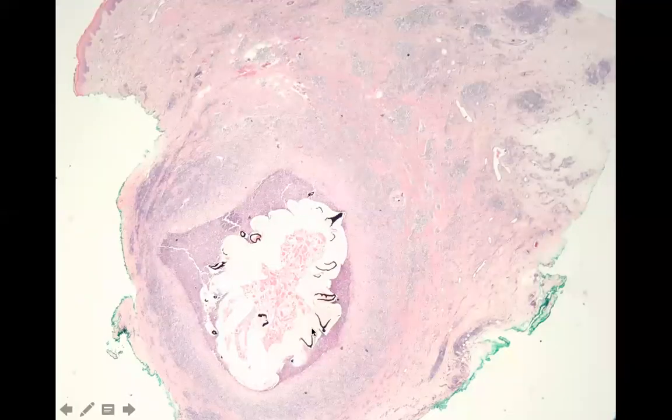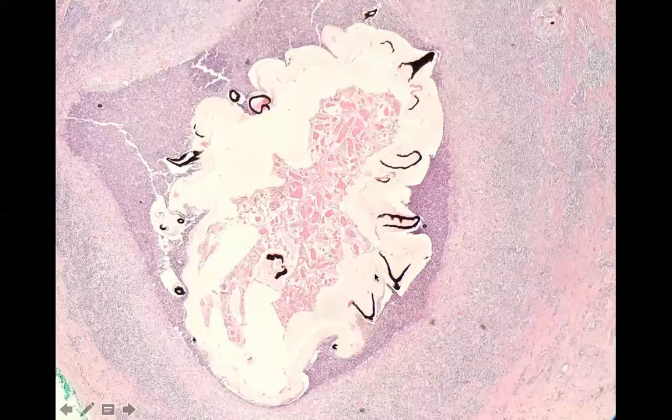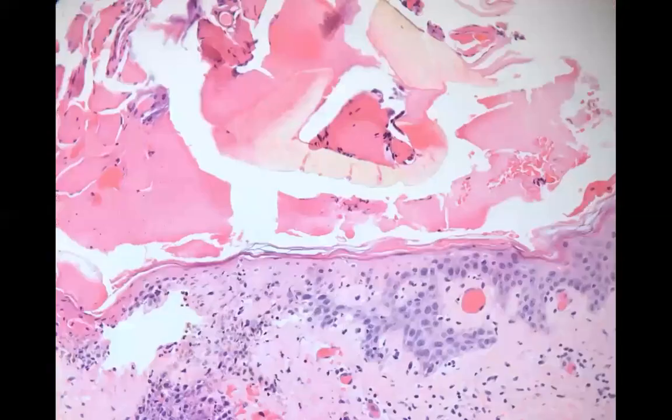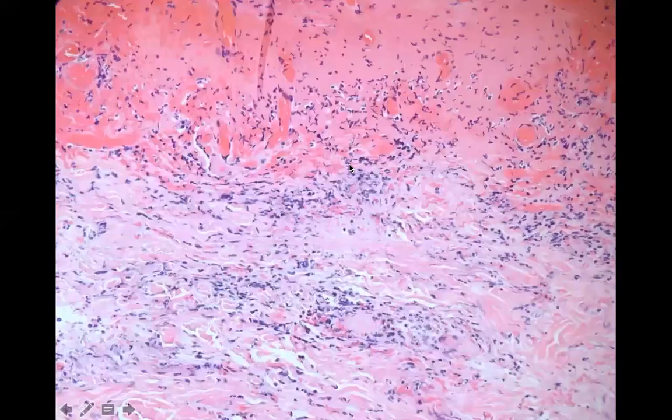This is the shape of a worm for myiasis. And this is the allergic infiltrate surrounding that. You can see the little guts, and it wouldn't have the yellow mouth parts that a tick would have. Closer look. This is a closer look at some mouth parts of a tick, yellow bits. This one happens to be superficial. We didn't catch it inside the tissue.